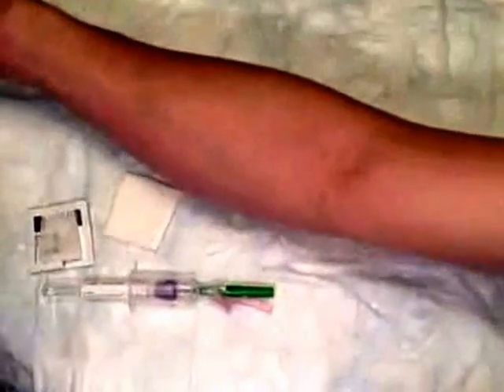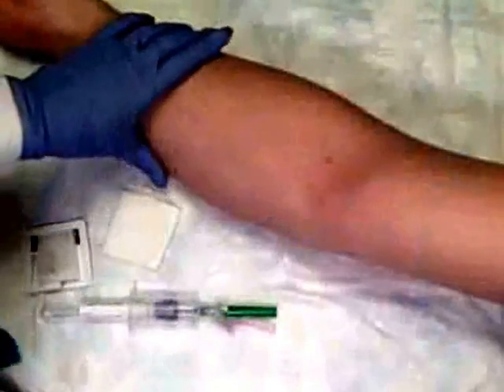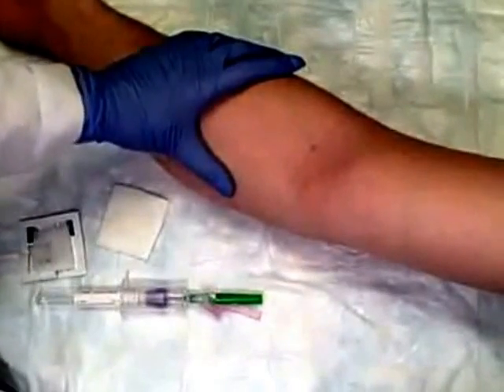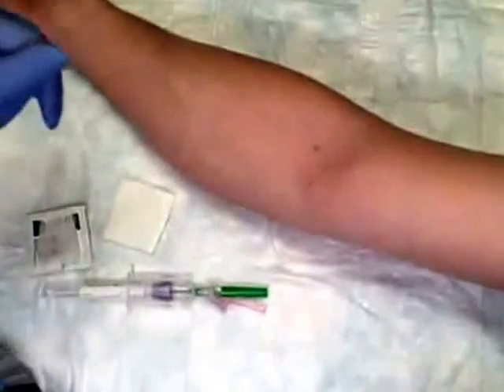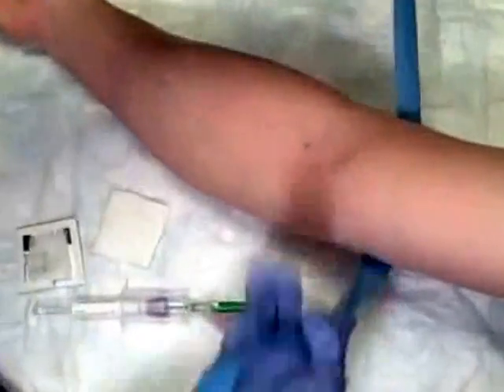We'll have our patient place the arm on the sterile area and explain the procedure. Today we're going to be performing phlebotomy — have you ever had phlebotomy before? Yes. Do you know of any good veins? Yes. Are they in your antecubital area here? Yes.